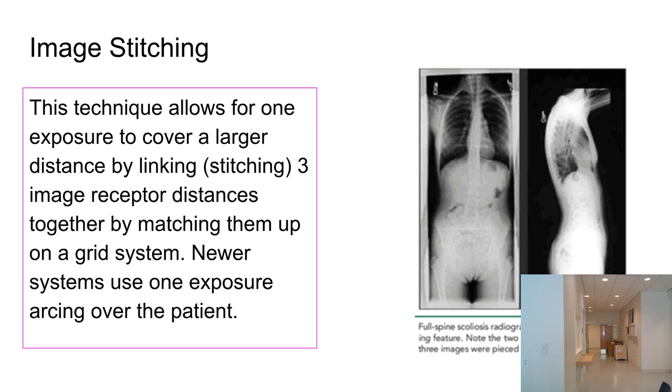Okay, so when we did this with screen film, we took this big thing into the dark room and ran it all in one piece. Now you have software that stitches them together. Here you can actually see the seams, but they're not physical. They're digital where the stitching occurs. And that's getting better. Usually they look seamless now, and you don't see that because it's an artifact.